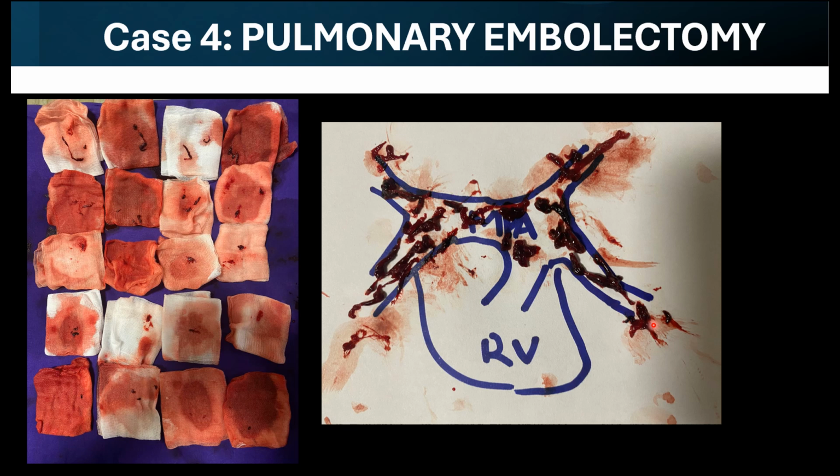So what actually happens is each and every time you aspirate, there will be more amount of blood coming for the small amount of clot which comes. So in this technique, in which I used an 8 French catheter, a large wide bore catheter which was braided, we were able to get more amount of clots.